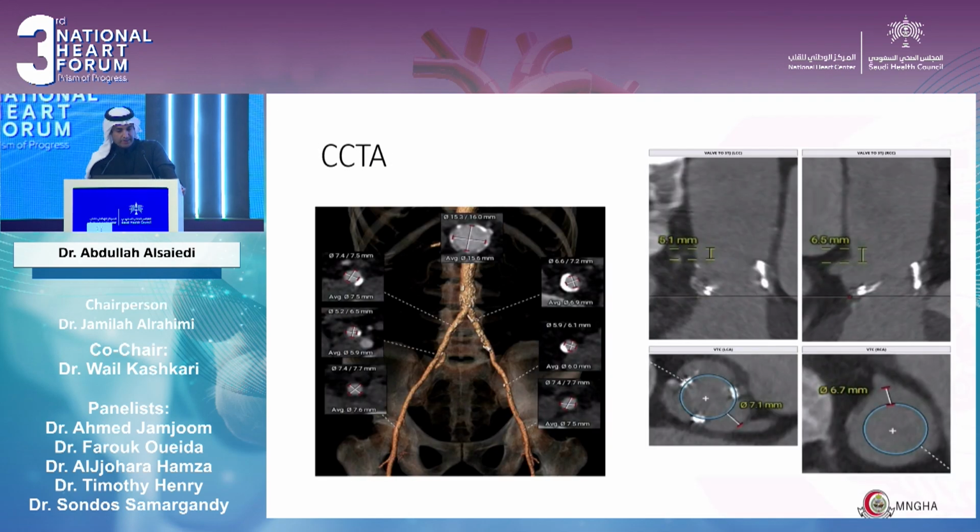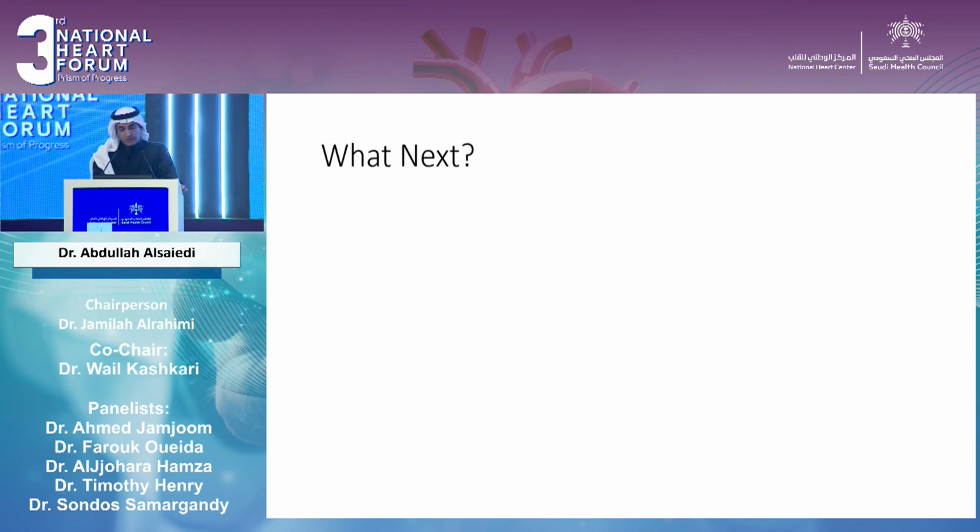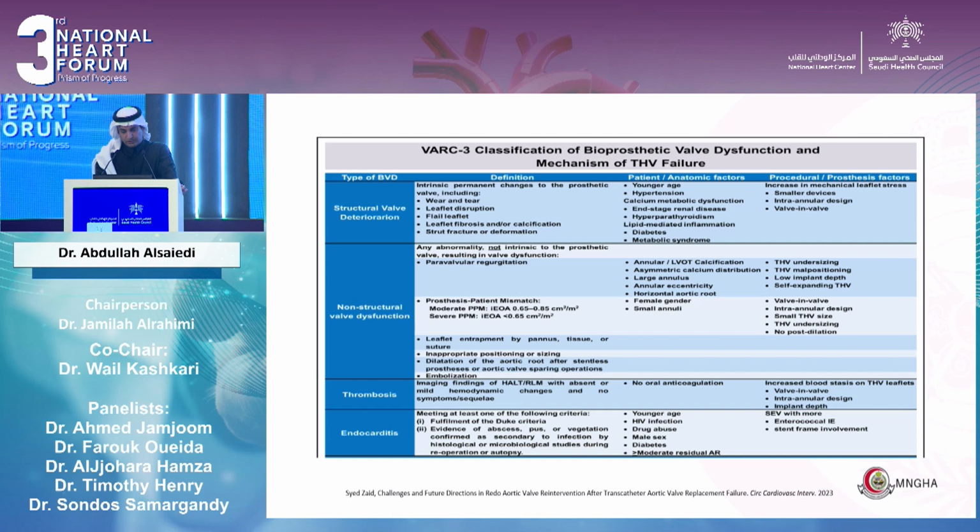Now, in this patient, in summary, he came with a degenerative surgical valve and symptomatic at this stage. Considering his age, the discussion was to proceed with TAVR in this case. So I'm going to come back to what we did in this regard for this patient, but I'm going to go briefly over what should be done in case of TAVR.